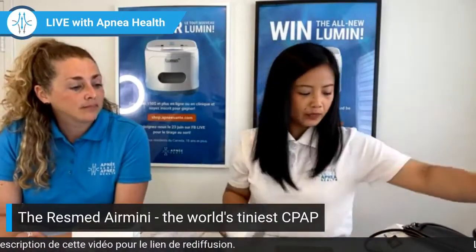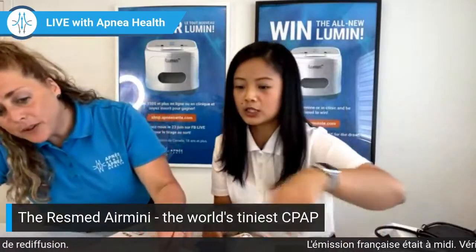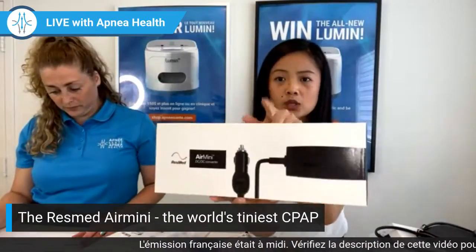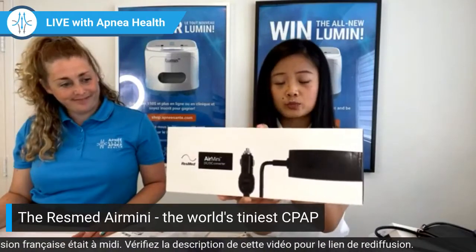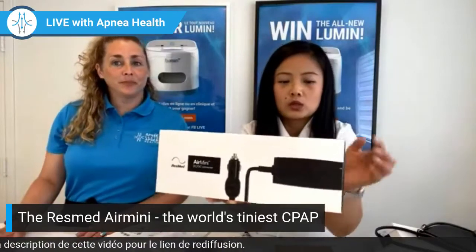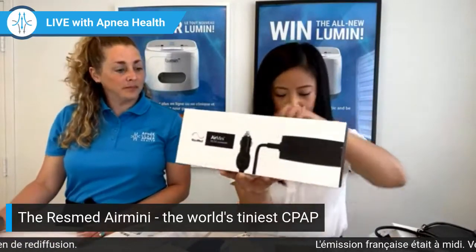So you have that. We also have the DC converter right here. Again, we went over this last week. If you're somebody who wants to go camping, or if you're a truck driver, I know a lot of my truck driver patients like this, because every truck has a cigarette outlet.